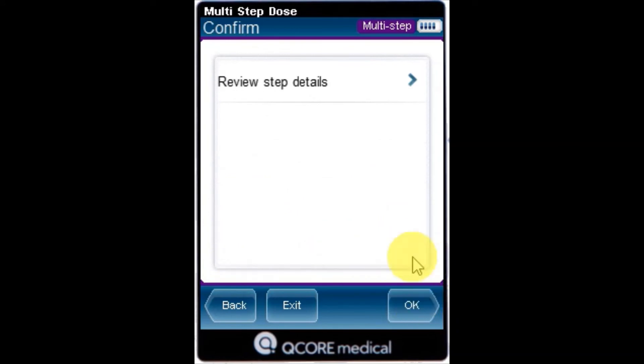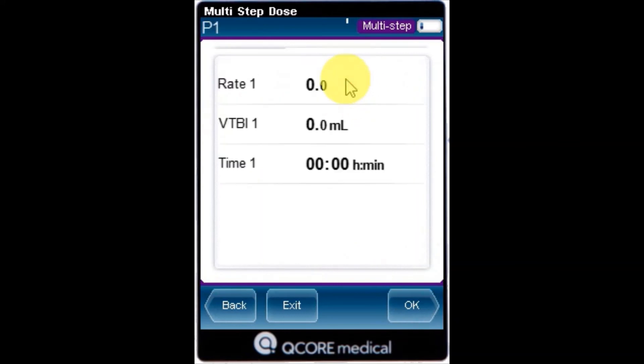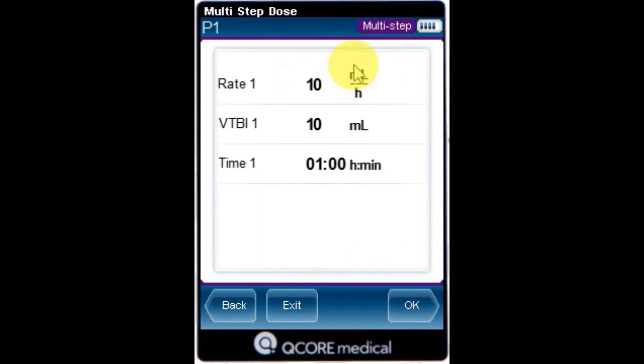Review the step details. Selecting this option displays the parameters of all program steps, screen by screen, with each step displayed on its own screen.